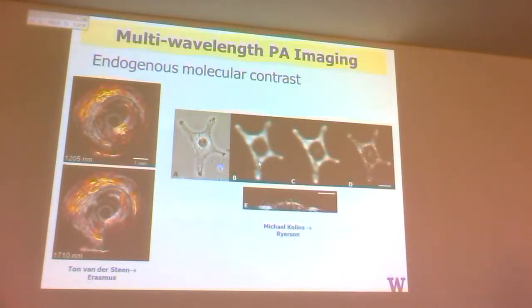Can I add something? Yeah. You keep distinguishing between only photoacoustics and photoacoustics plus ultrasound. Yes. In both cases, you use the same type of transducer for receiving, right? Right. It's only a question of whether you also use it to transmit. Right. And it's sort of a technical detail, but there are trade-offs.